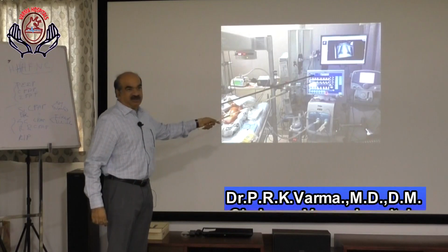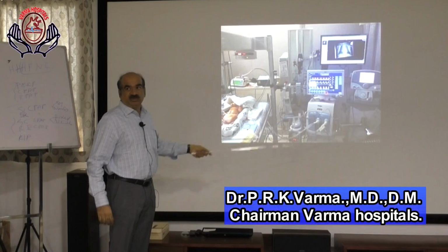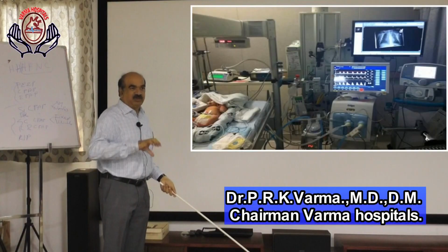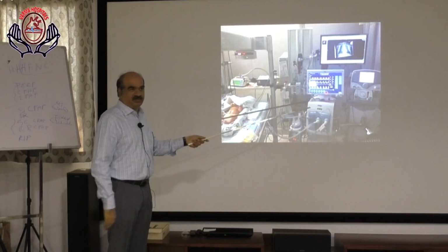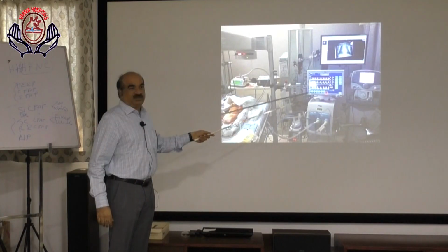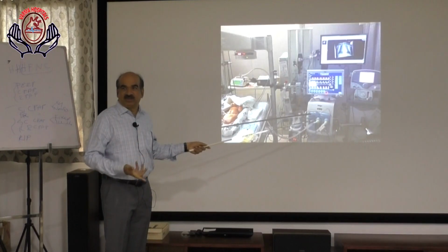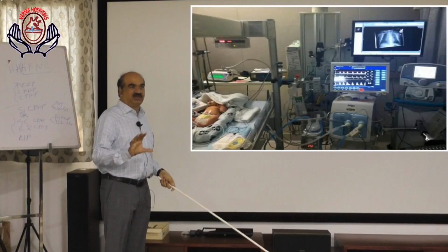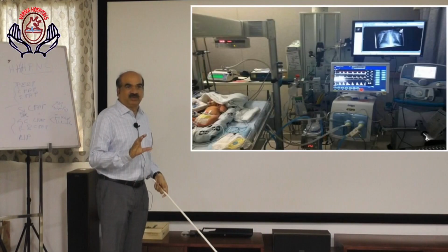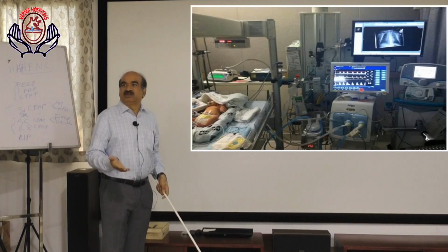X-ray and ventilator monitor, showing graphics. Among the two, which is more useful for continuous monitoring? X-ray is useful for initial diagnosis and for planning of the management. Which is useful for continuous monitoring of the baby? Definitely ventilator graphics. X-ray just gives the initial diagnosis. It is useful for making the diagnosis and for planning the treatment, that's all.